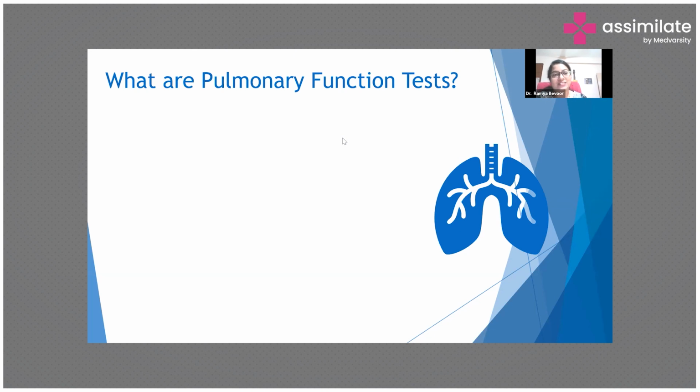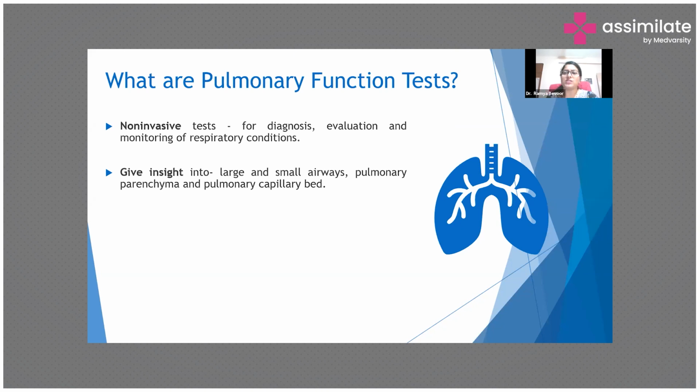So pulmonary function tests are non-invasive tests which are used for diagnosis, evaluation and monitoring of various respiratory conditions. What is the use of these tests? They give us an insight about the respiratory system, basically the lungs, especially the large and small airways, pulmonary parenchyma, the pulmonary capillary bed. They help us measure different volumes and capacities like lung volume, lung capacity, rates of flow, oxygen, carbon dioxide, gas exchange, things like that.